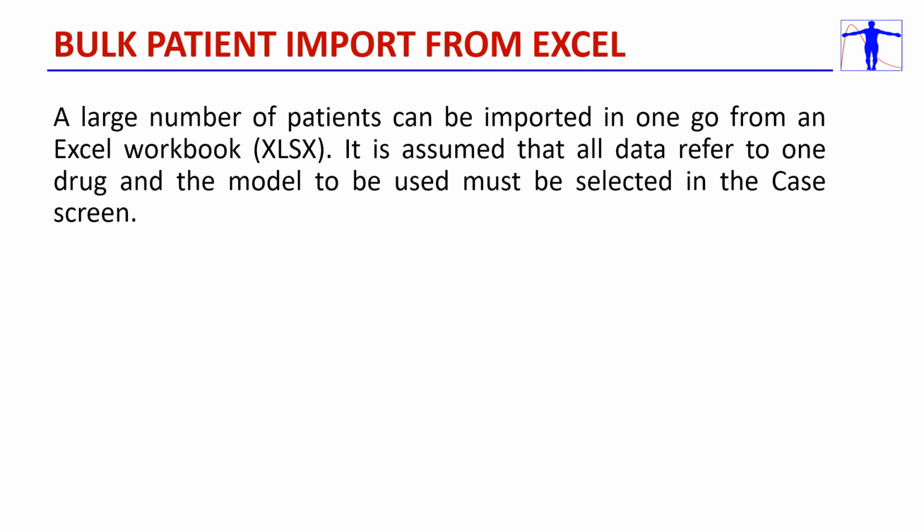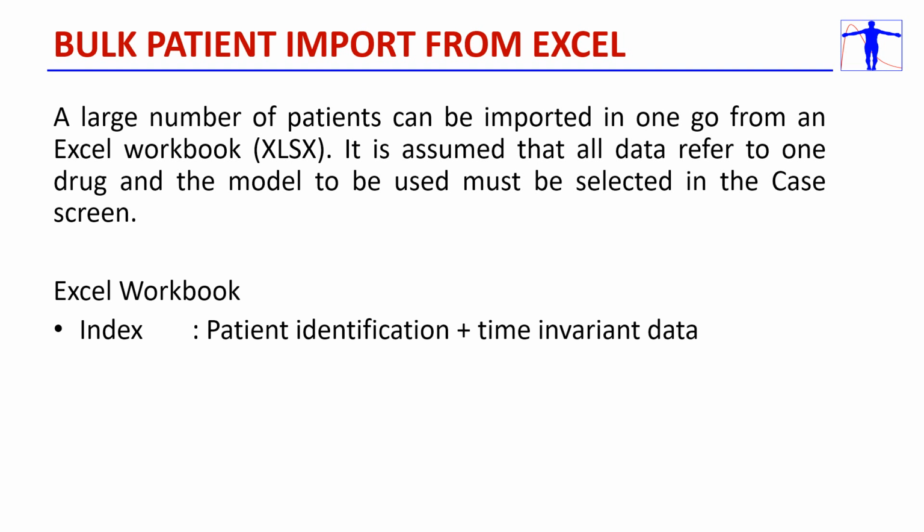So, it's important that if you bulk import a large number of patients from an Excel workbook, it is assumed that the data refer to one drug, and the model to be used must be selected in the case screen. So you have an Excel workbook, and it has to have two sheets.